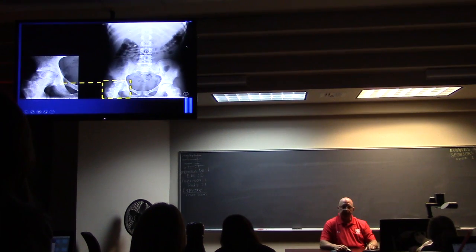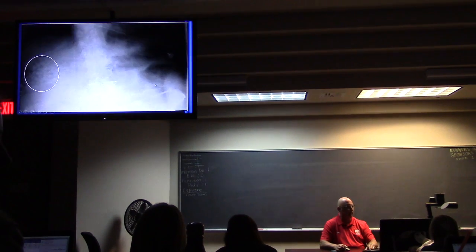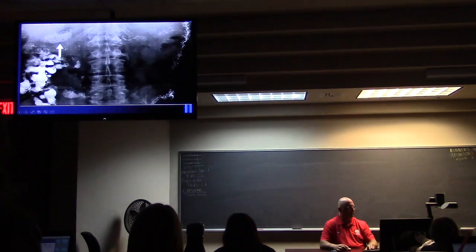Getting abdominal films for this lady with abdominal pain, but oh, look at that. Her femur's getting eaten away. She's got something bad now. That was just, oh, by the way. This is what gallstones look like. I think Scott's talking about that this afternoon. There they are. They look like little pearls in the right upper quadrant.